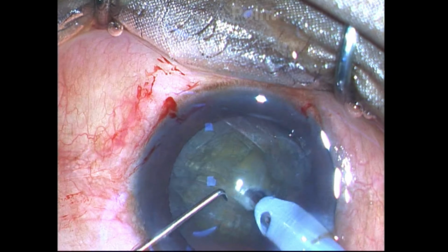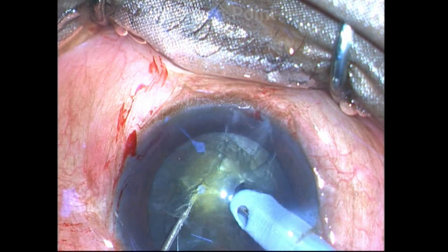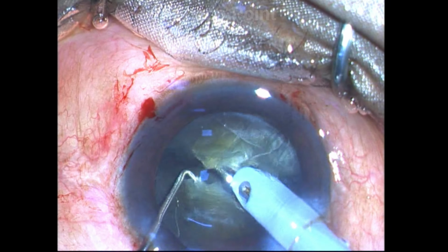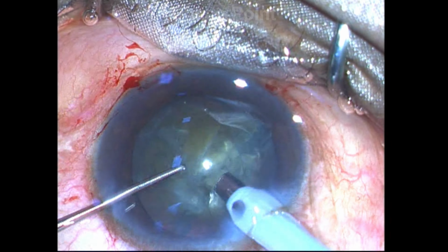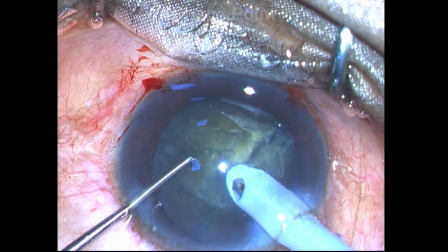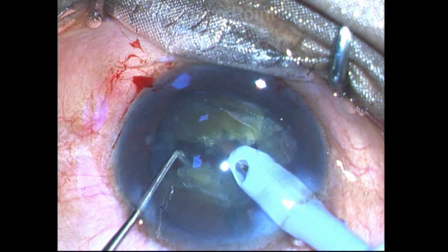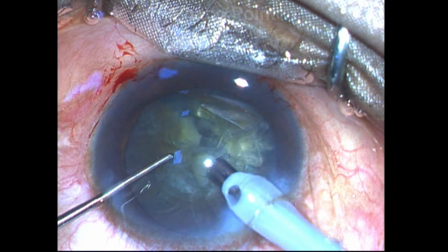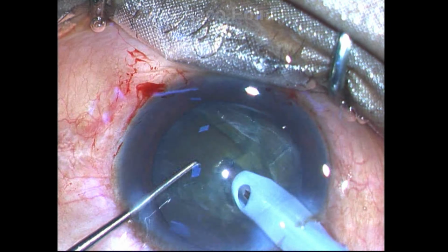In the phaco mode, the surgeon impales into the nucleus, and after acquiring fixity, the second instrument now is introduced beyond and distal to the tip, and a lateral separation of both instruments results in a chop. After rotating the nucleus, the same procedure of chopping the heminucleus now into smaller fragments is also done. In this manner, the entire nucleus is now subdivided into much smaller emulsifiable fragments.